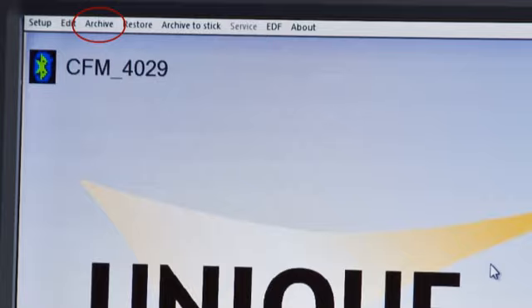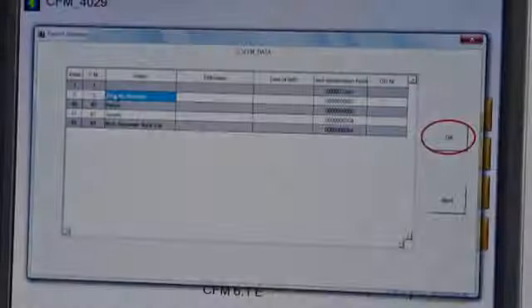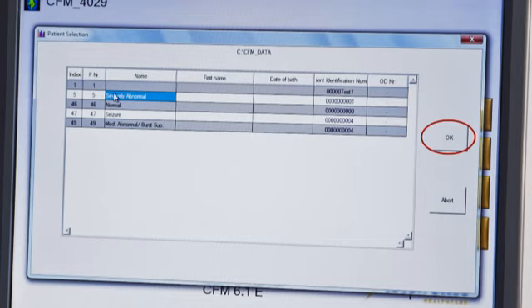To archive to disk, click on archive at the top of the master screen. This will remove data from the computer.